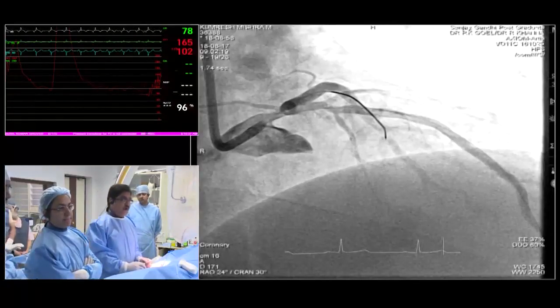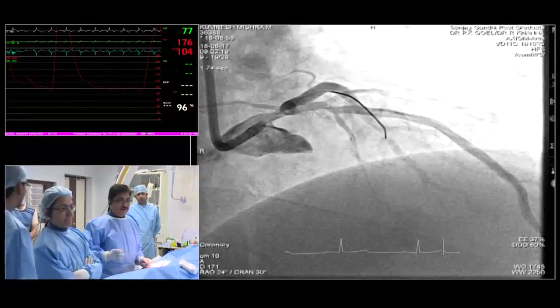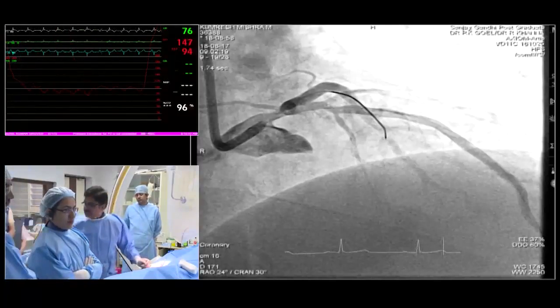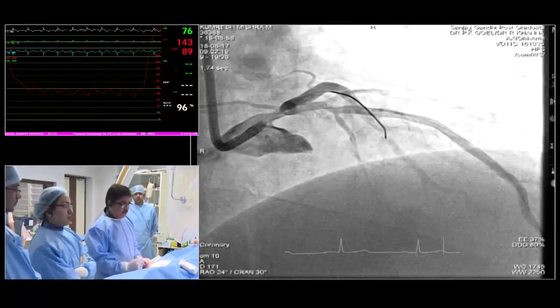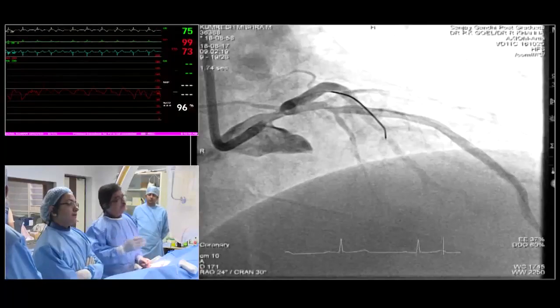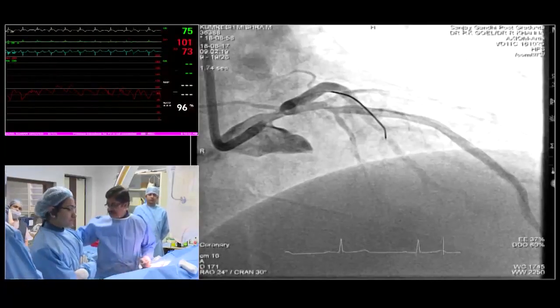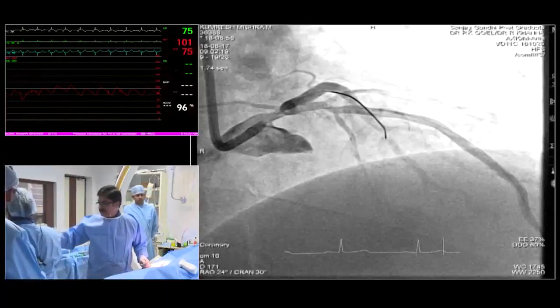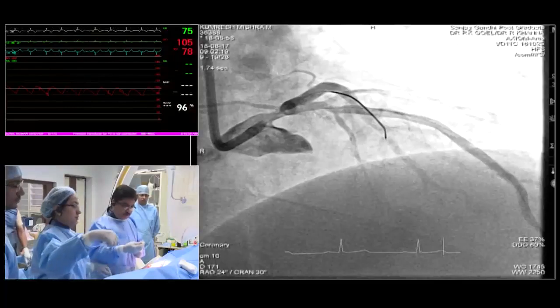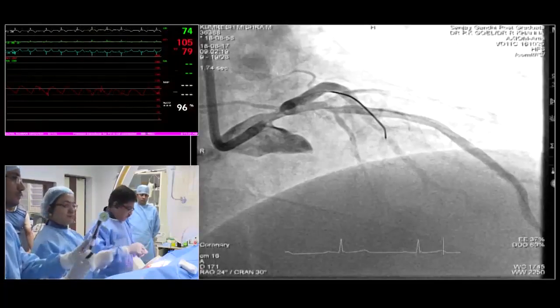18. I don't think there are ways to cover. I will not want to. You see, I will cover according to anatomy. Whatever the anatomy calls for, I will do accordingly. So let us see. Okay. Let's see. I'm going to do it. You can see what I do. Whether I reach the ostium or I don't reach the ostium, I am also not very sure.